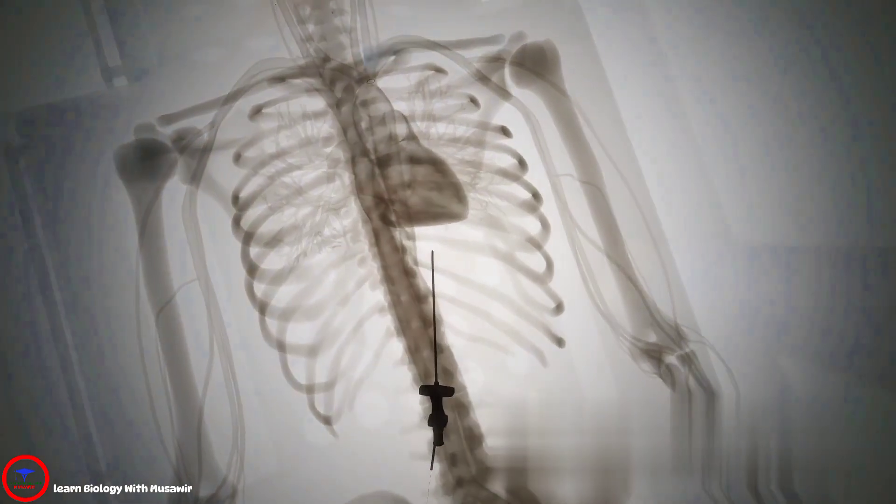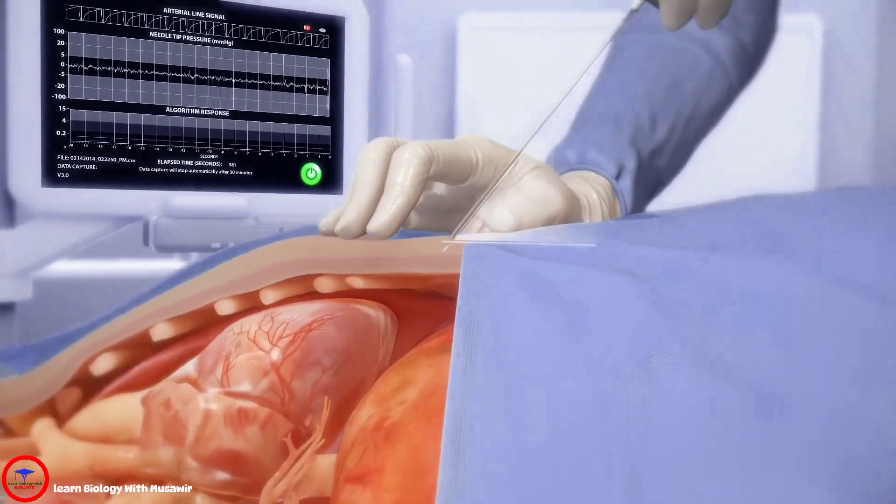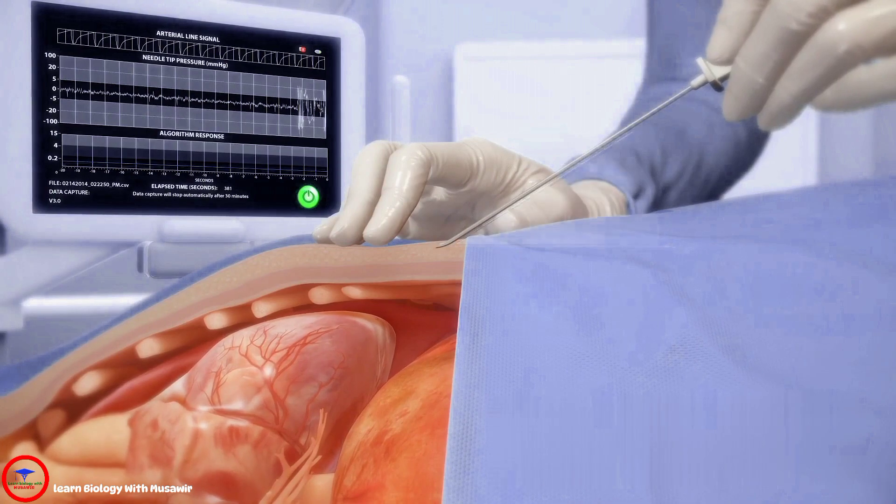The needle is inserted through a sub-xiphoid incision. The angle of insertion is deeper for a posterior procedure and shallower for an anterior procedure.